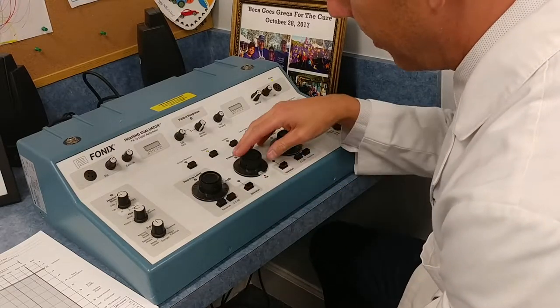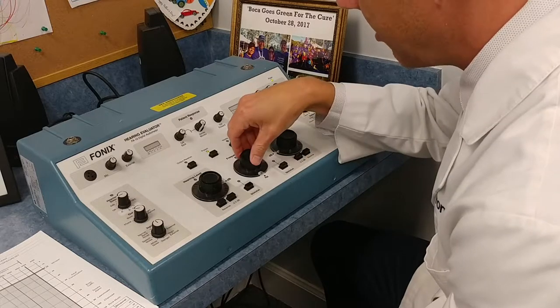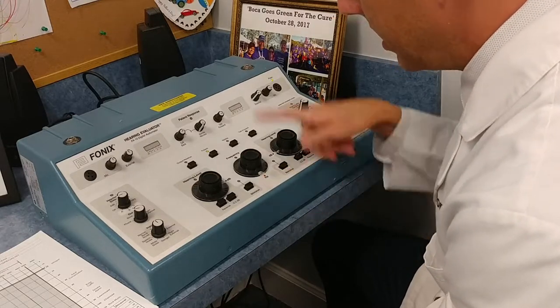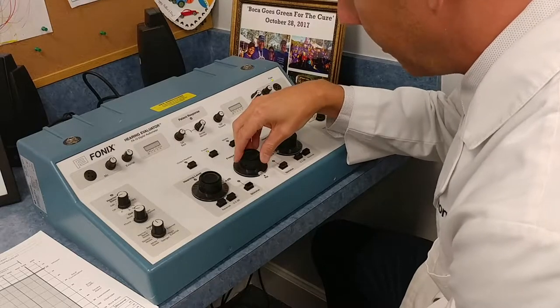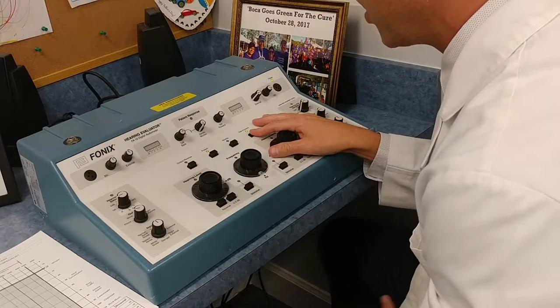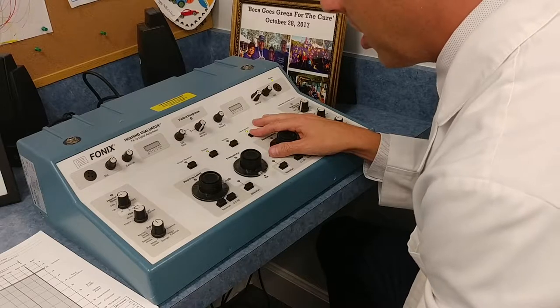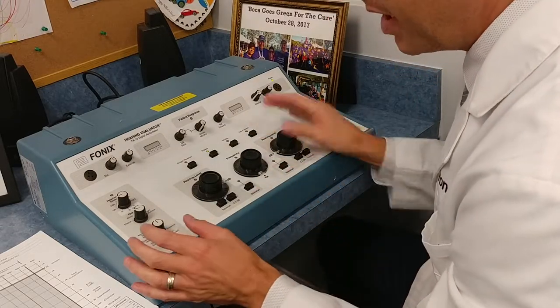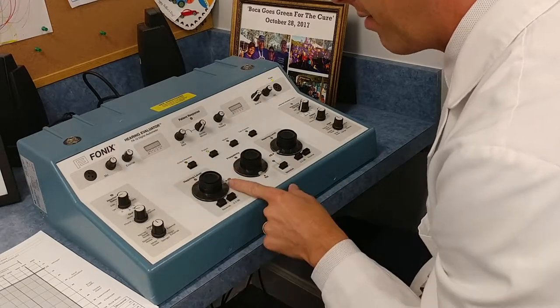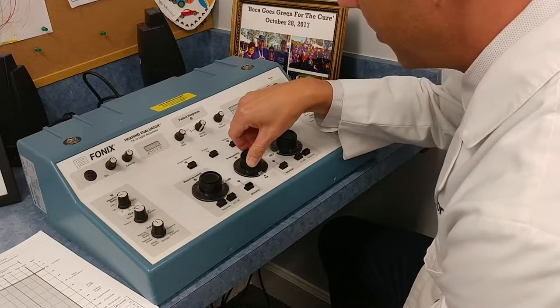Starting at 1,000, I'm going to go to 1,500, 2,000, and 3,000 using the same technique until I reach 8,000. I'm going to come back to 1,000 and always double-check my work to make sure it's correct. I will then move down to 750, 500, and 250. I'll let the patient know they're doing a great job, check in that they're comfortable in the booth — not too hot — and then let them know I'm moving to their left ear. All settings should be the same; I'll start at 1,000 again at 40 dB, use my up-5-down-10 method, then move up to 8,000.